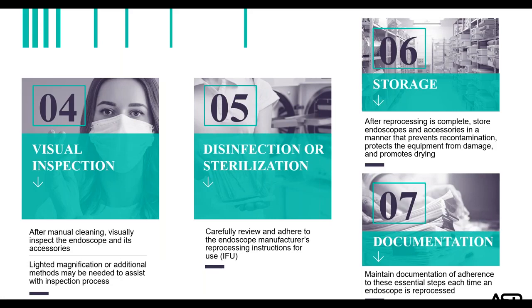Then endoscopes and endoscope accessories, what your current list is, what's gone out for repair, what's been retired, and processing equipment. So this would be record of preventive maintenance on your equipment as well as corrective maintenance. So having that handy. This information, again, is available on the CDC website.